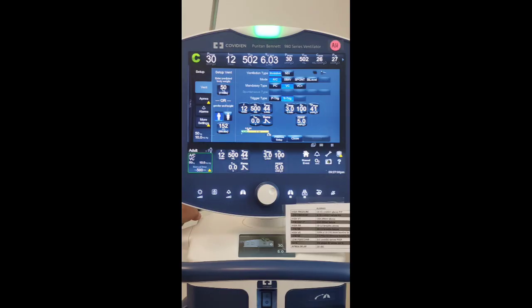That was kind of a round number, kind of on the lower end of the range, to minimize any possible lung injury, barotrauma. So I just decided to go with a little lower number. I could have gone to 475 if I wanted, but 500 is fine.